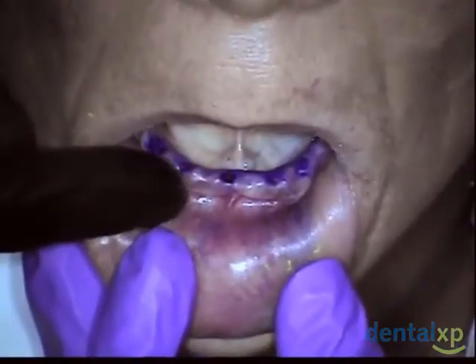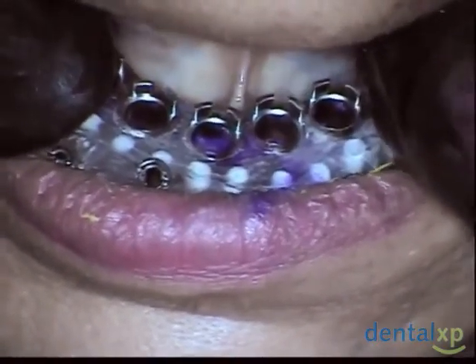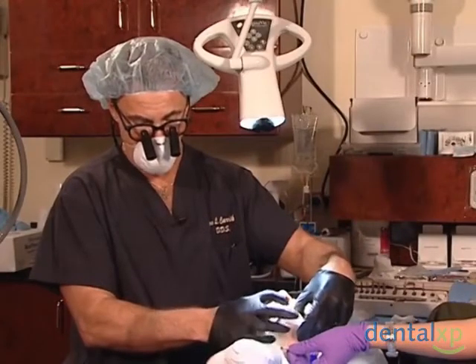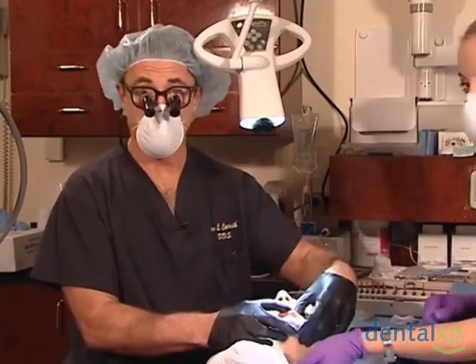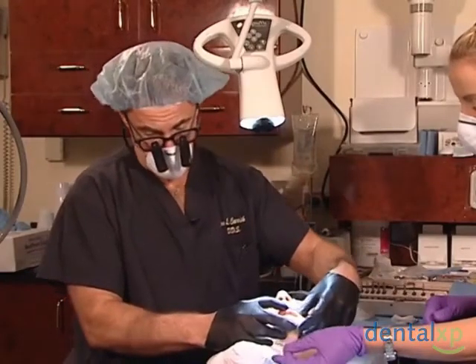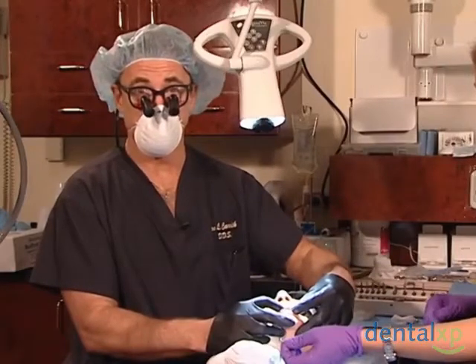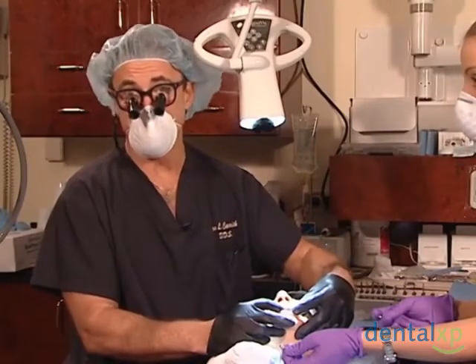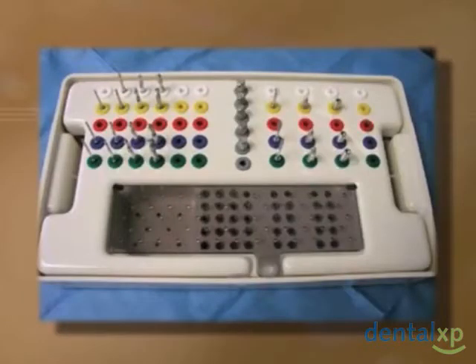We're going to reposition our lower stent and place our retention pins so that it is stable. On Patricia, this is a very stable appliance and we probably wouldn't need to do this, but it certainly doesn't hurt — tongue movement while placing the implants could alter the position. In the maxilla with a high vault you'll find it may not be necessary. The first thing we'll be doing is providing a 2-millimeter preparation preselected through the software, positioned so it doesn't interfere with the primary implants or jeopardize the neurovascular bundle. The ILS system is pretty foolproof.